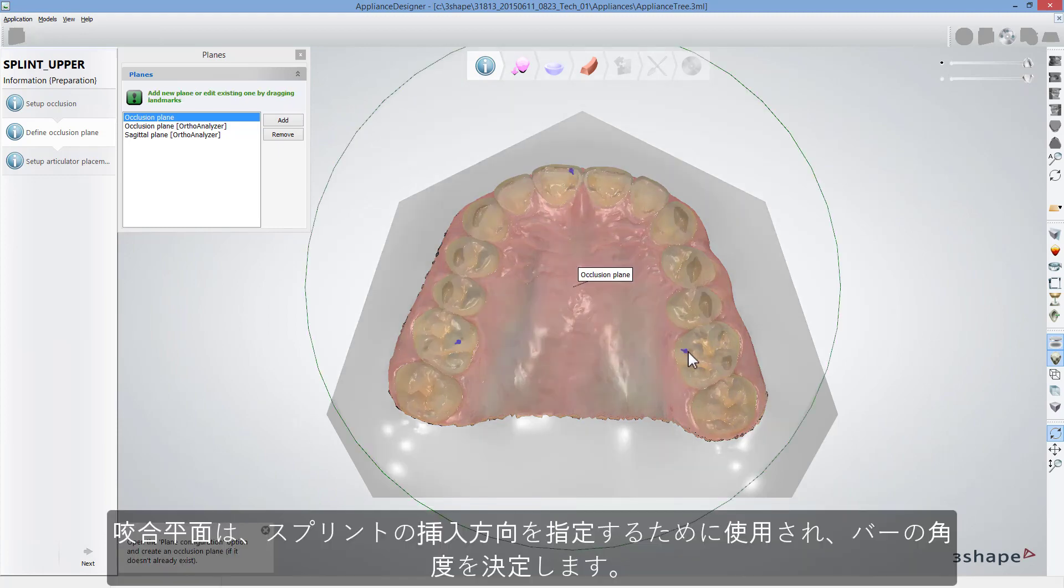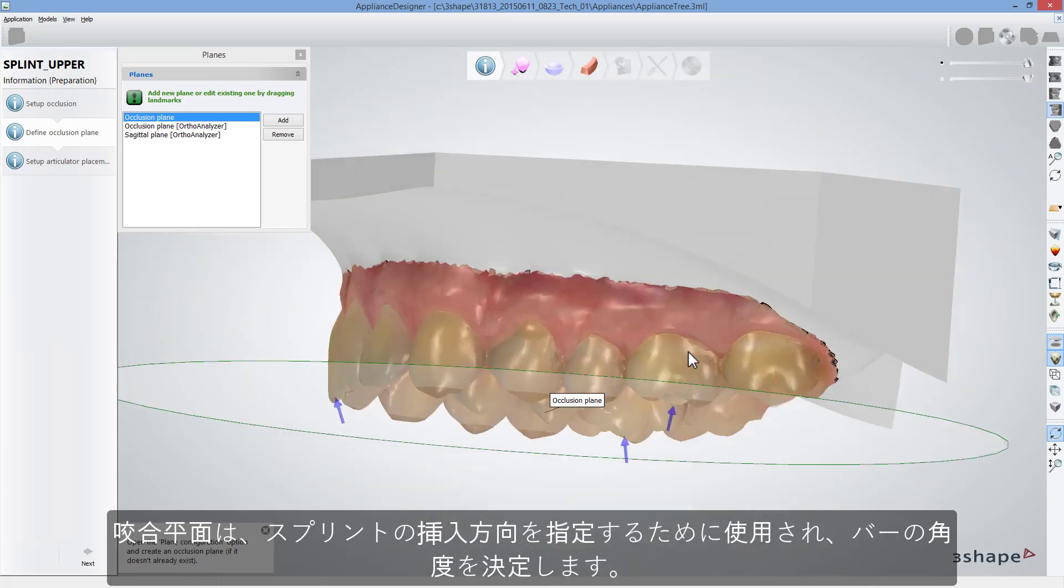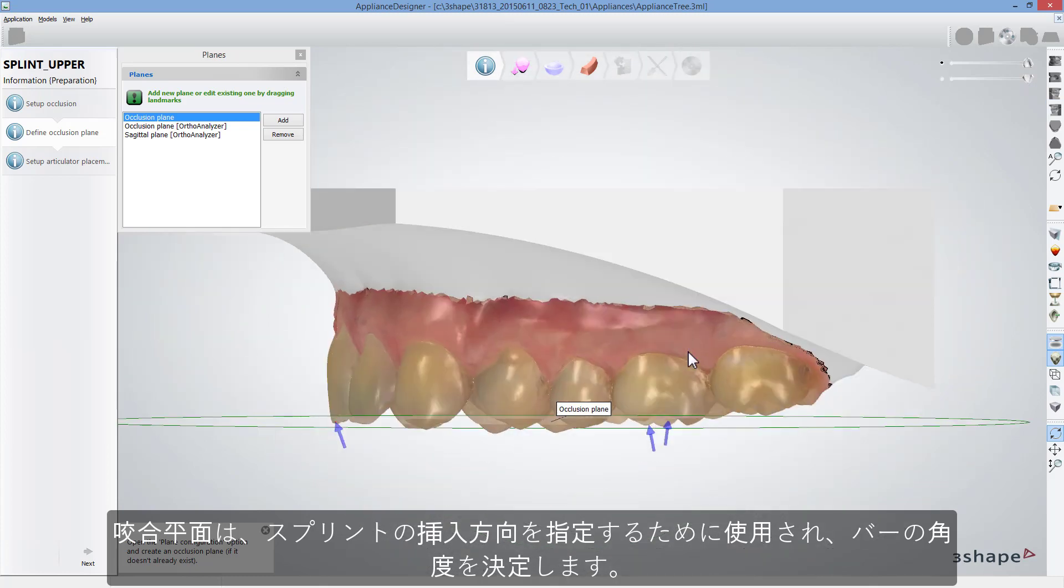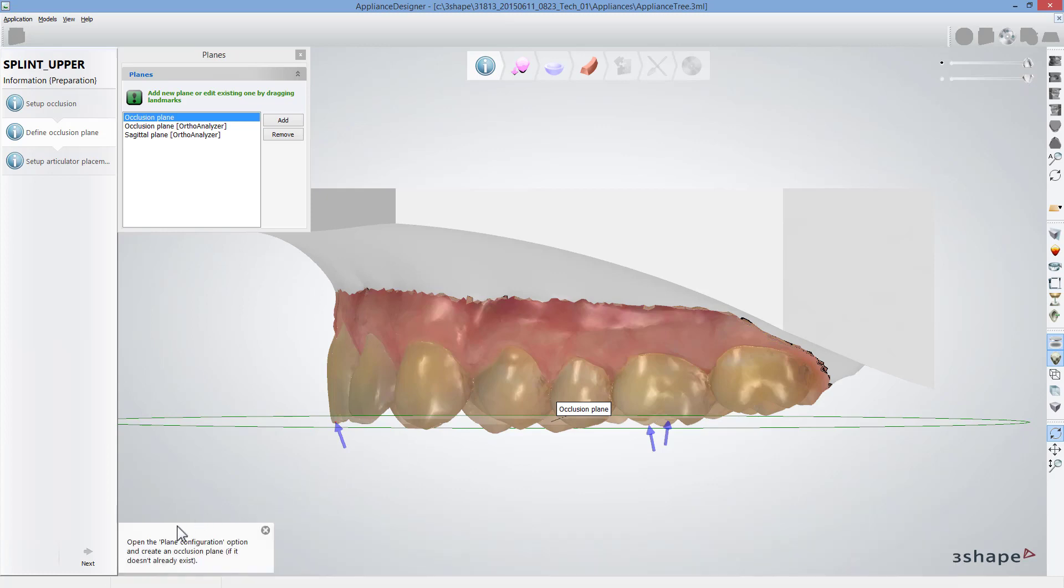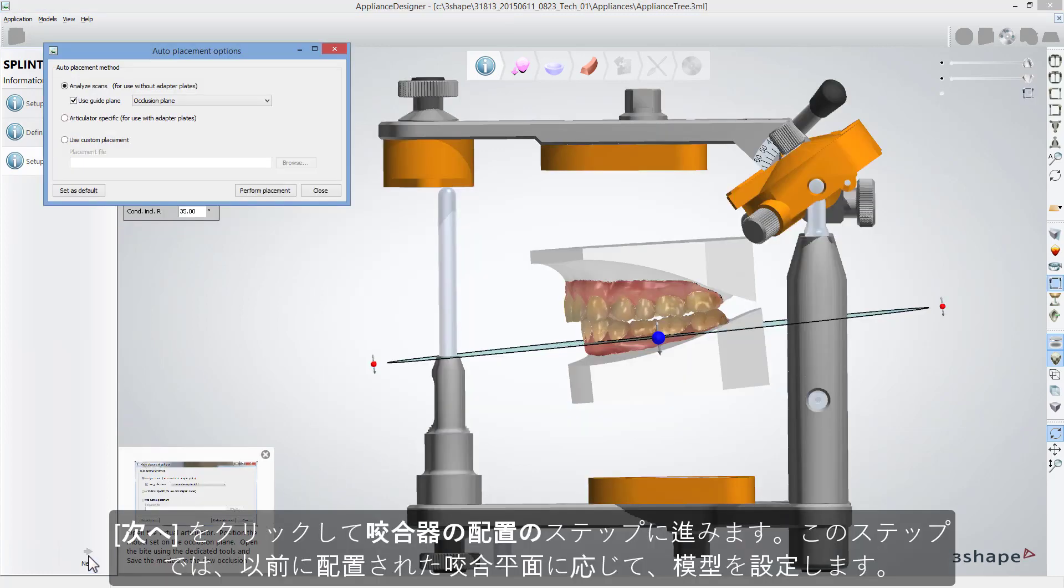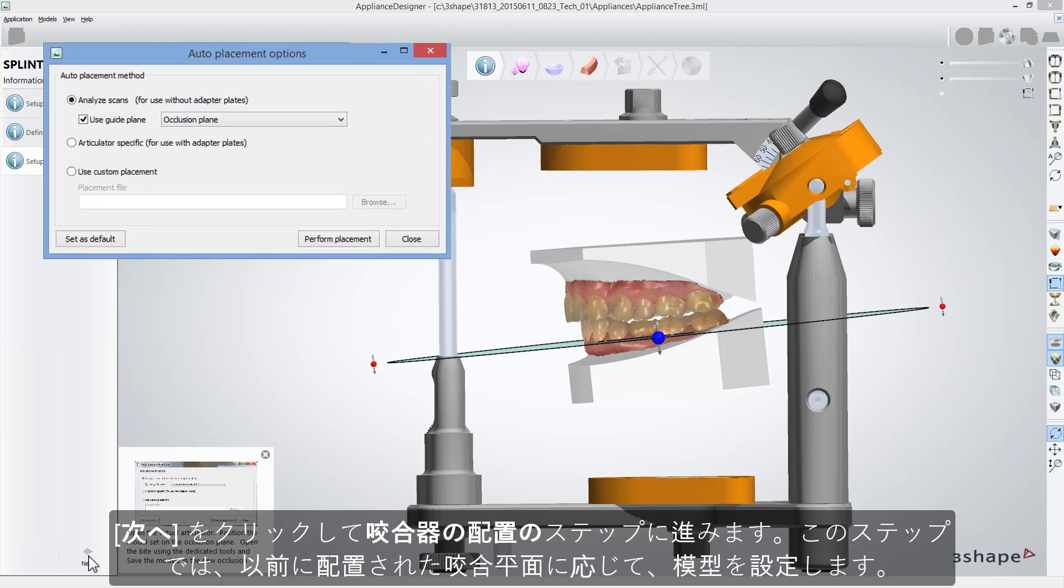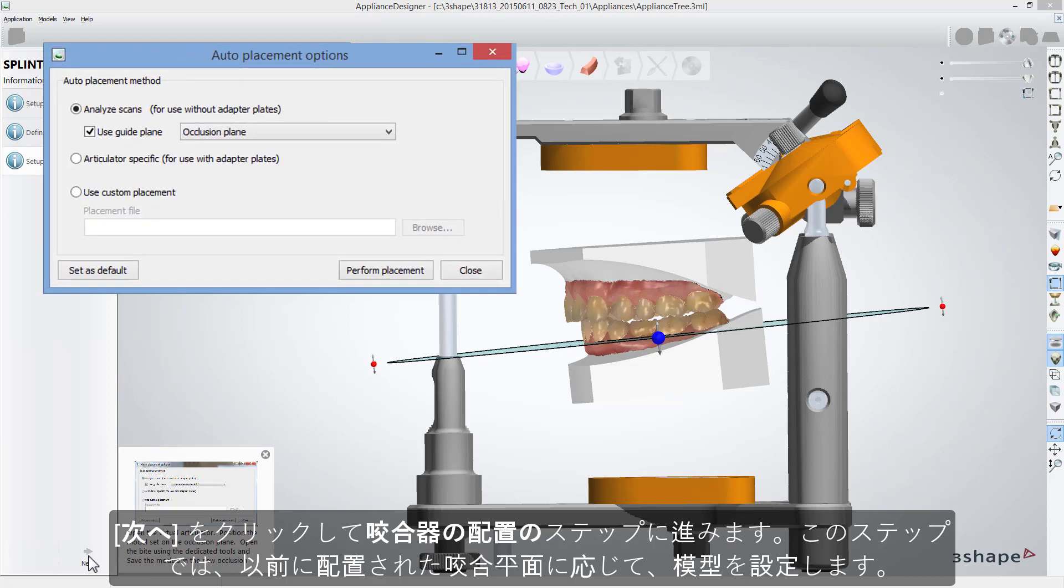Occlusal plane will be used to define the initial insertion line of the splint and will determine the angulation of the bar. Now click Next to get to the Sculpt Articulator Placement step to set models according to one of the occlusal planes.